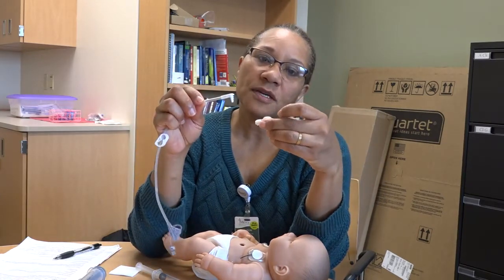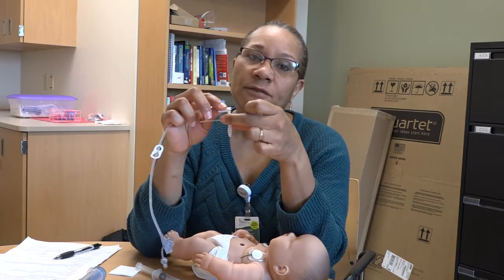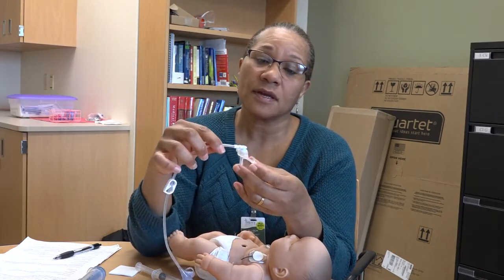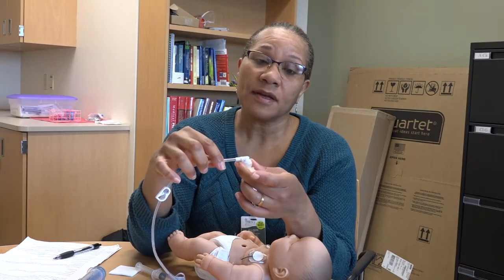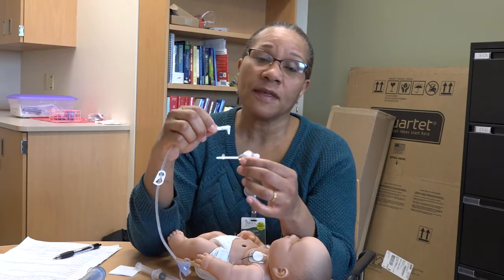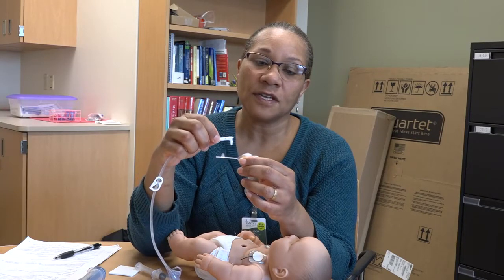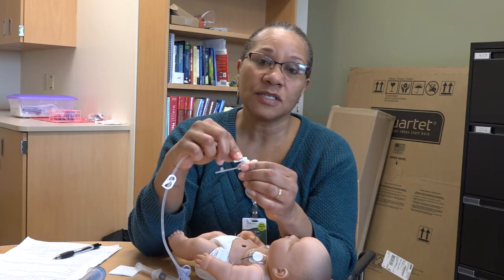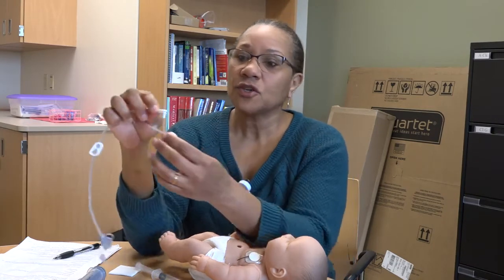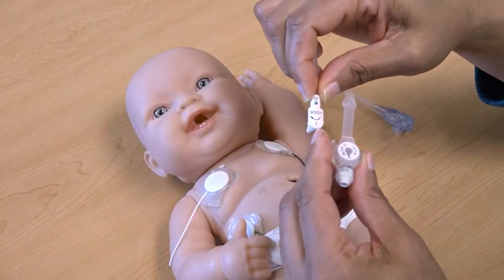This feeding extension tubing is going to be attached to the G-tube when your baby comes back from surgery, and it's going to stay in place for 2 weeks. And after that 2 weeks is up, then you can take the feeding port off and then only use it when it is feeding time. The reason why we keep the feeding port attached is to decrease the amount of manipulation to that fresh G-tube site.